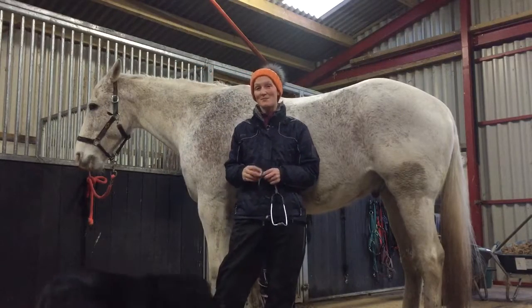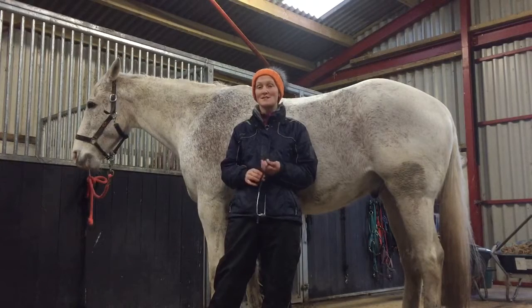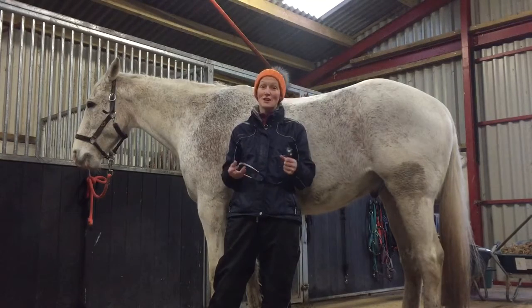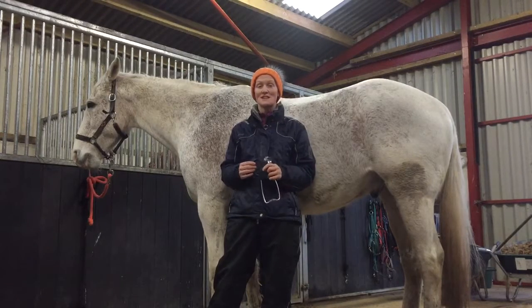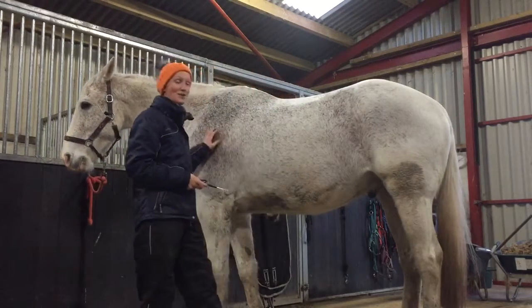Hello there, my name is Caroline Marsley. I'm a Clinical Skills Teaching Fellow at the Royal Dick School of Veterinary Studies. Today in my short video for the BBC Natural History Unit, I'm going to talk to you about how to use a stethoscope and how to listen to a horse's heart.